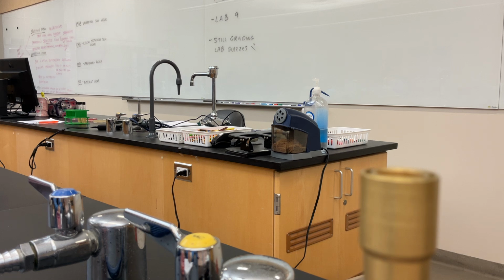And that's important because what if we're wrong and the patient doesn't have salmonella? So we're encouraging that if there is salmonella present, it will grow faster. But if it's not present, we'll still get growth. Maybe they have O157, maybe they have Shigella, maybe they have something else. So we'll still be able to grow that organism, we're not inhibiting it. It just won't grow as fast as our salmonella target would.